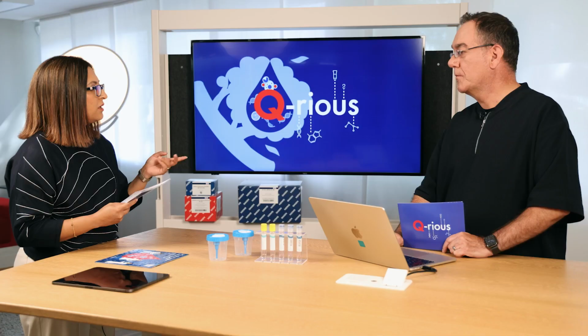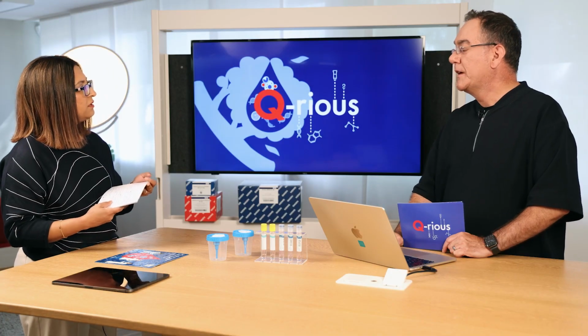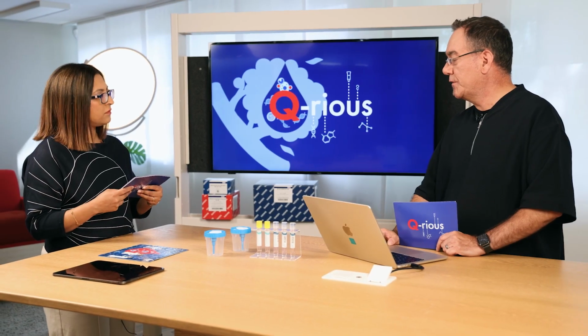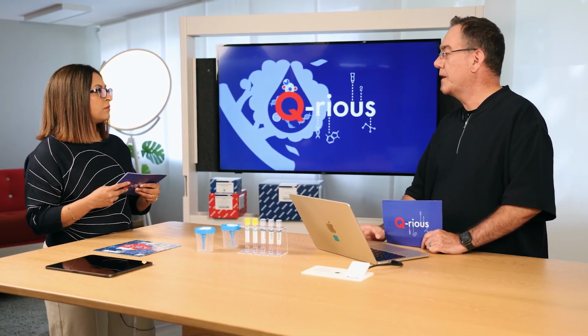Can we use the samples that are drawn from normal EDTA tubes? Is that also possible? Yeah, that's possible too. The only downside of this approach is that EDTA plasma is only stable for 2 to 4 hours at 2 to 8 degrees. So you need to do the analysis right away, and you need to cool the sample all the way. While, for example, with the PAX-gene blood cfDNA tube, you can store the sample up to 10 days at room temperature, 15 to 25 degrees.